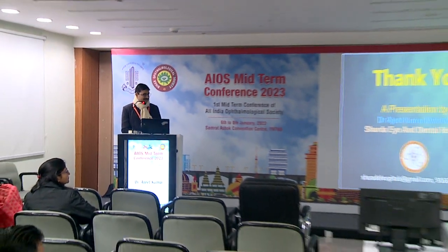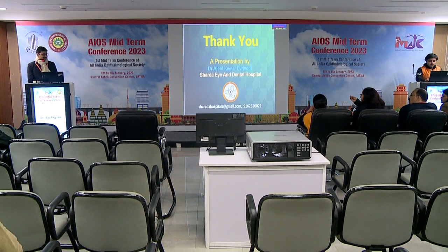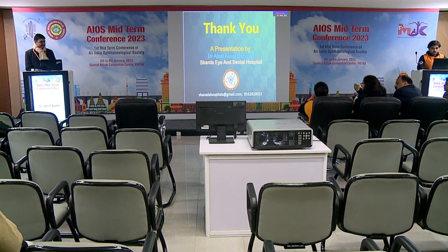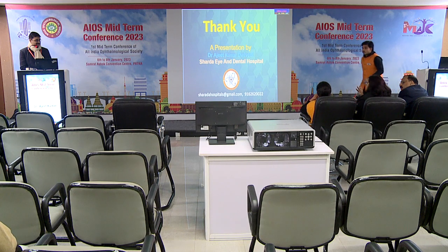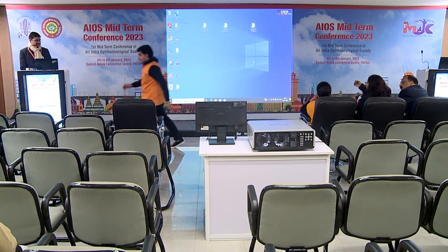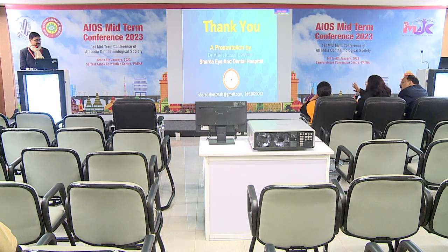So what I did is I put an implant for the volume correction. It was a very small eye, a severe phthisical eye. I did an evisceration and put an implant. First I corrected the volume, and then for the surface contraction I did an AMG. My message is to evaluate both parts and do correction for both parts. Then your patient will be happy, like the young girl you have shown. If you assess the volume, the superior sulcus deformity gives the idea of how much volume is there.